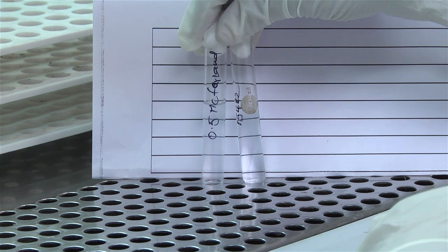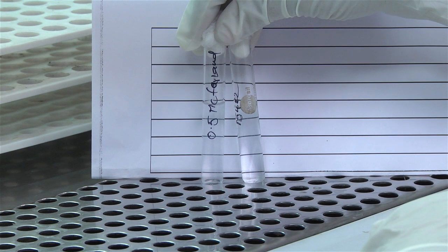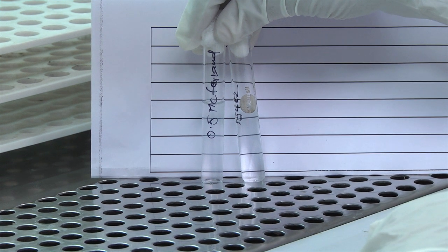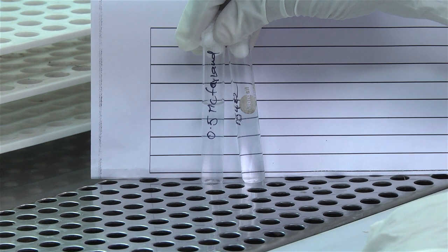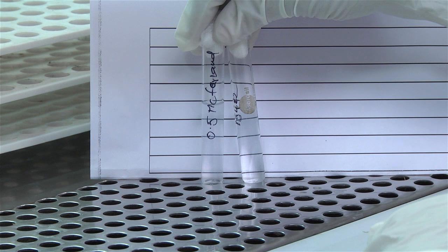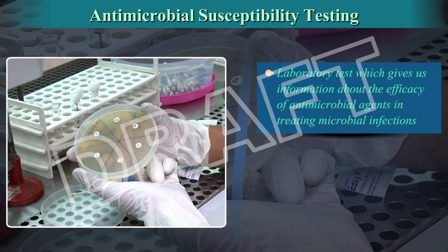Match the turbidity of the suspension to the 0.5 McFarland turbidity standard in good light. Mix the standard immediately before use. When comparing turbidities, it is easier to view against a printed sheet of paper. Label the base of the Mueller-Hinton plate with sample details.